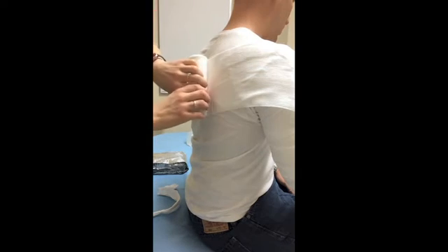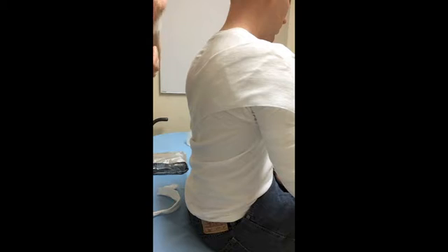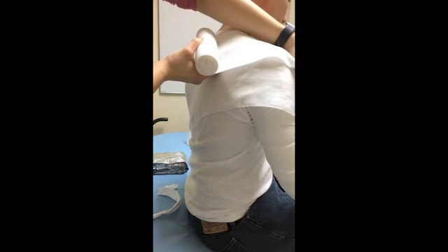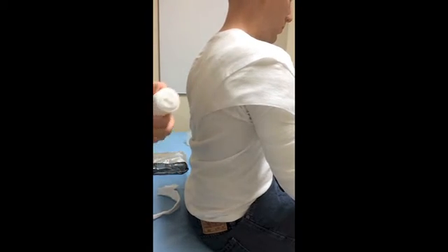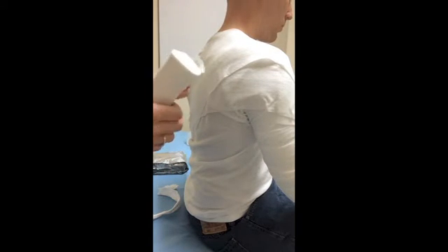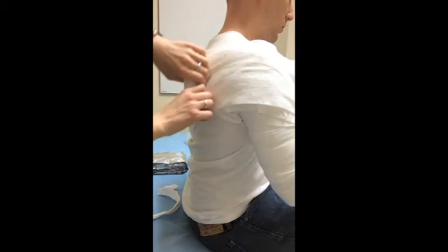Overlap slightly with itself, and then we're just going to tear that off so we've got plenty of padding in the back. It's a bit harder to get 3 consistent layers back here, but the point is just to protect the patient's skin. Some movement does happen with this splint in the back because it doesn't get secured to anything. So we just want to keep the patient's skin integrity in mind as much as we possibly can.